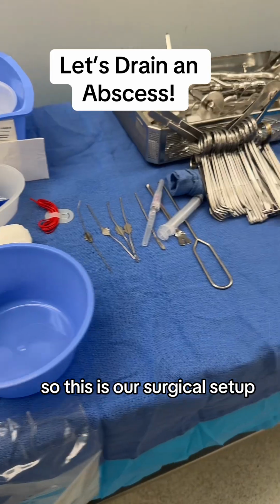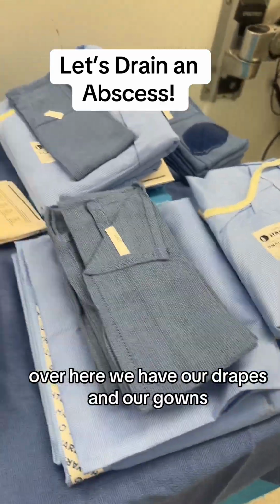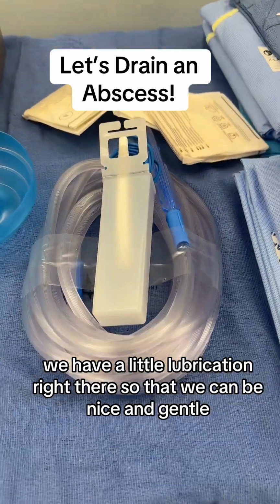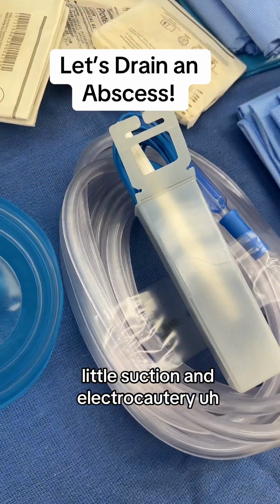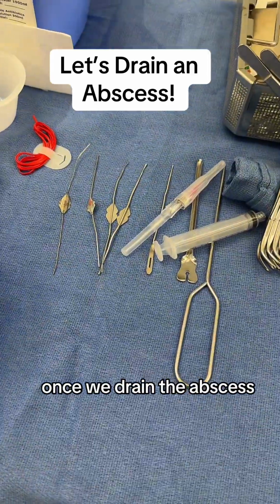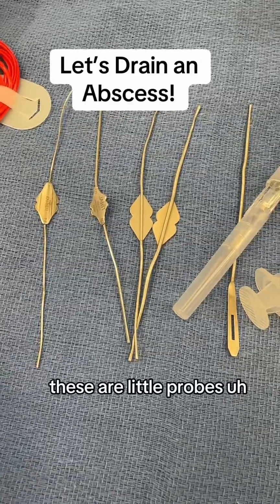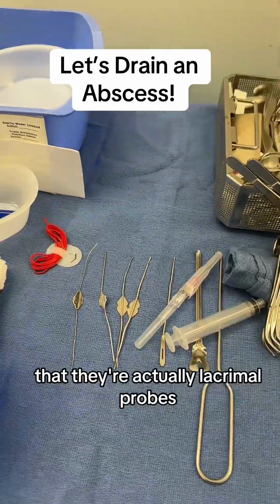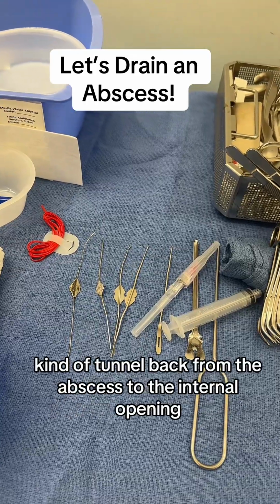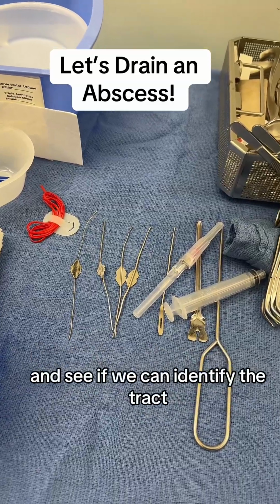So this is our surgical setup, kind of simple and straightforward. Over here we have our drapes and our gowns. We have a little lubrication right there so that we can be nice and gentle. A little suction and electrocautery to help us get control of any kind of bleeding. Once we drain the abscess, we then go ahead and use these fistula probes. These are actually lacrimal probes, and we use them for anal fistulas, and this allows us to tunnel back from the abscess to the internal opening and see if we can identify the tract.